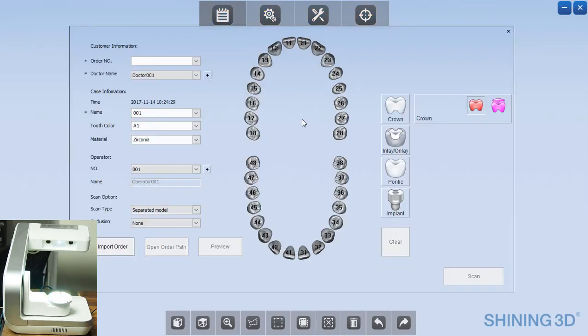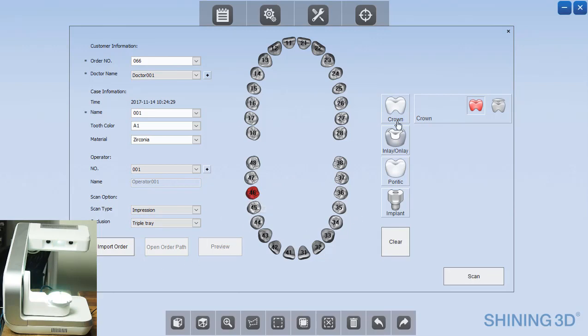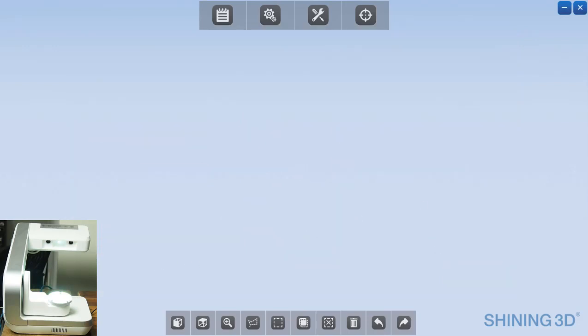Once the impression has been trimmed, it's now time to scan it inside of the Shining3D DSEX scanner. So I'm putting in the patient name, doing a scan type of impression, and the occlusion as triple tray. We'll be doing a crown on number 30.